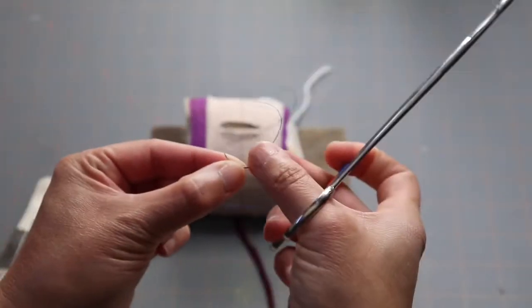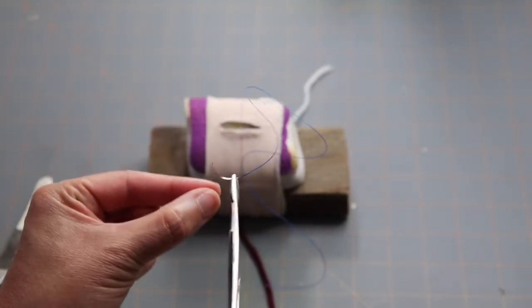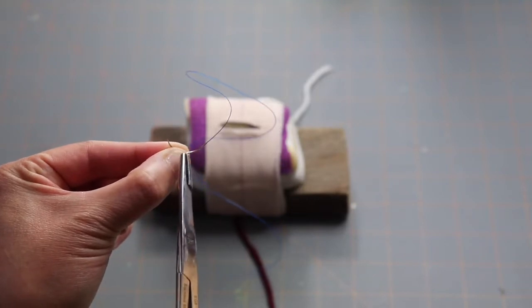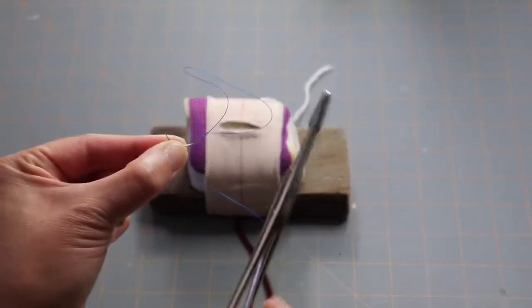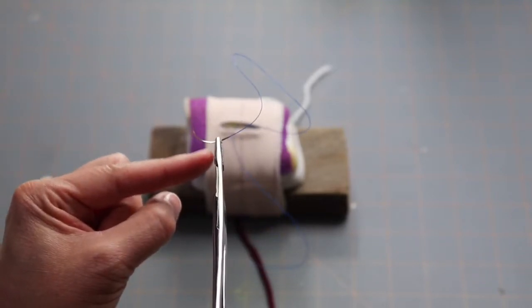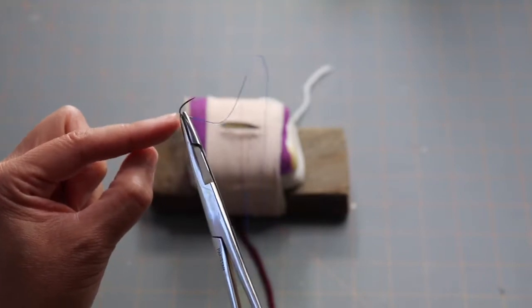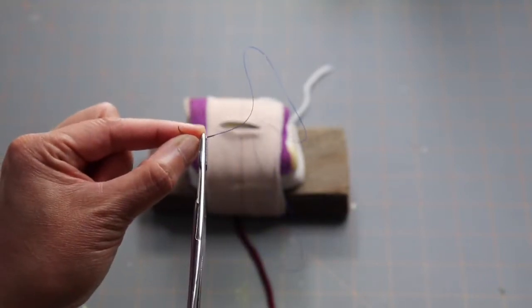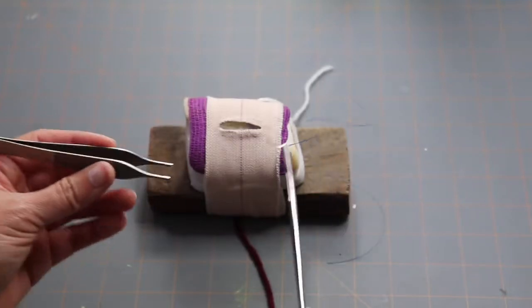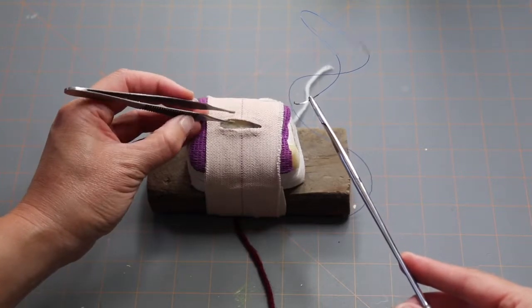Make sure you hold the needle at the back part — the caudal third or fourth towards the swaged end. You don't want to hold it at the cranial part of the needle because that will dull the cutting edges as you pass through skin. Hold it towards the tips of the needle holders at a 90-degree angle — that gives you the most leverage. You'll need your thumb forceps, and now you're going to hold the far end of your incision with your thumb forceps.